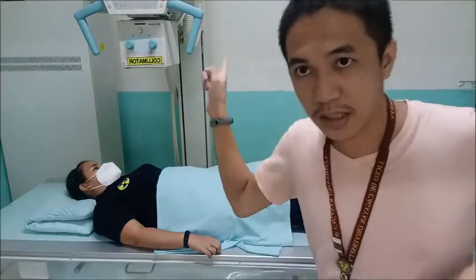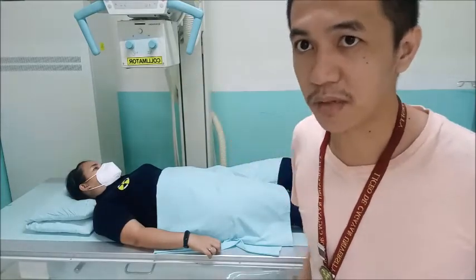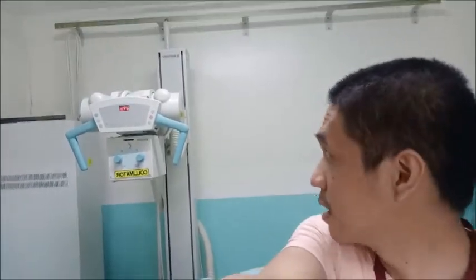Okay? So earlier, for example, when the patient was seated in the wheelchair, what we do with the X-ray tube is still the same. Some X-ray facilities have ceiling-mounted X-ray tubes. This is a wall-mounted or floor-mounted assembly for our X-ray tube.